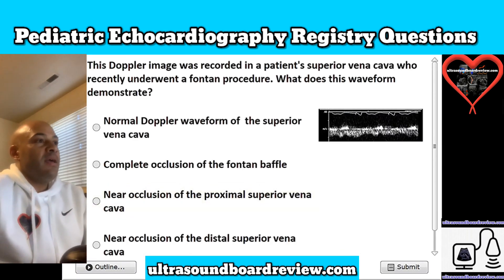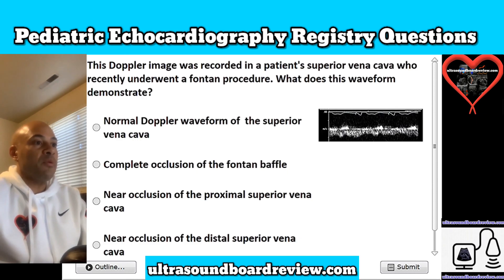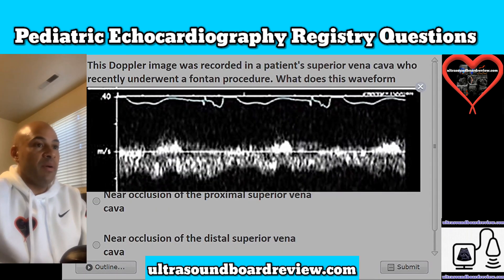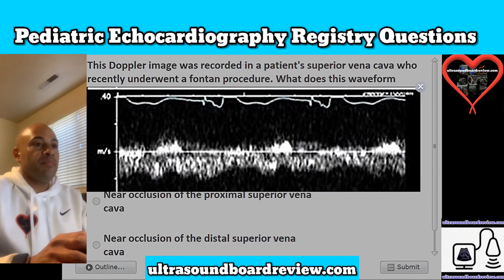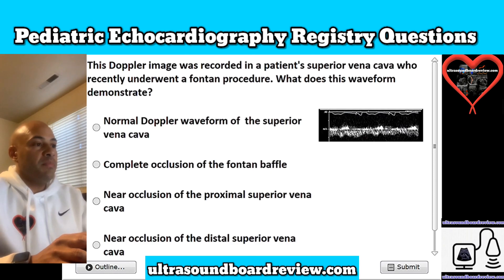Question 10. This Doppler image was recorded in a patient's superior vena cava who recently underwent a Fontan procedure. What does this waveform demonstrate? Is it A, normal Doppler waveform of the superior vena cava; B, complete occlusion of the Fontan baffle; C, near occlusion of the proximal superior vena cava; or is it D, near occlusion of the distal superior vena cava? The answer is D, near occlusion of the distal superior vena cava.